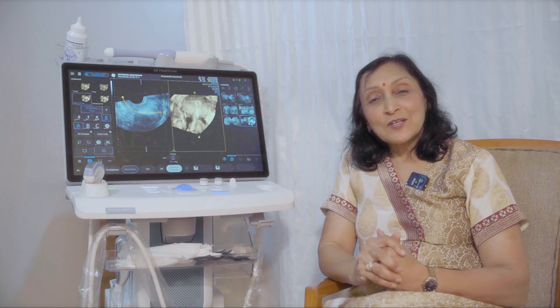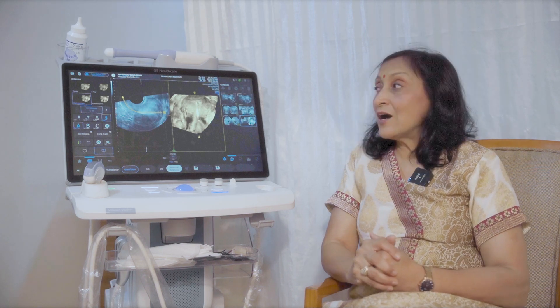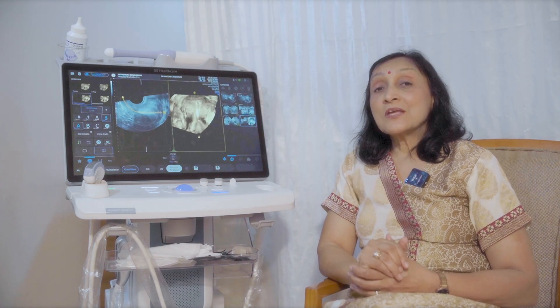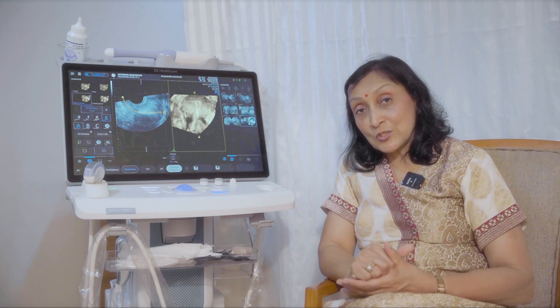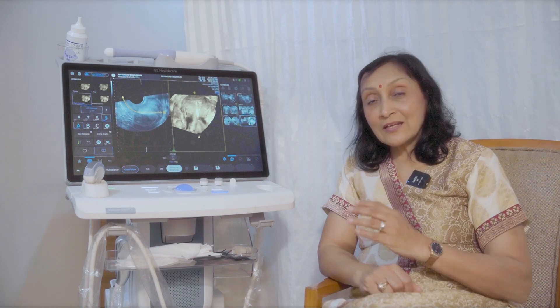It's truly Swift because everything — all the knobs, all the switches on this machine — are on the touch screen. Therefore, it makes it very easy for us to handle the machine, to shift over from one function to the other, to select the probes, and to select the application.